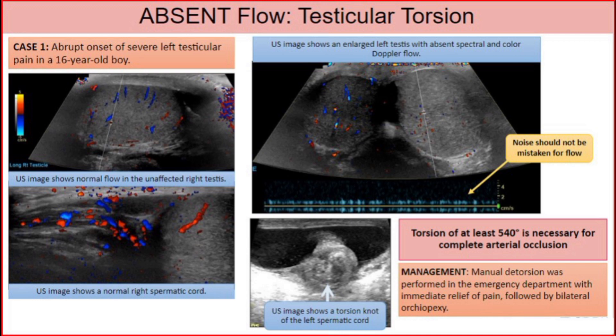Absent flow — testicular torsion. Case 1: Abrupt onset of severe left testicular pain in a 16-year-old boy. Images on the left show ultrasound with normal flow in the unaffected right testis, and below is an ultrasound image showing a normal right spermatic cord. Torsion of at least 540 degrees is necessary for complete arterial occlusion. Management: manual detorsion was performed in the emergency department with immediate relief of pain, followed by bilateral orchiopexy.